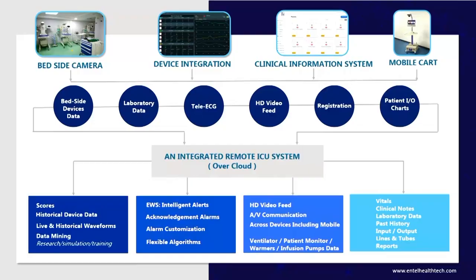You can set alarms from here because now there is a protocol-based solution for all these newer advanced monitors. If the medical officer doesn't know that this patient is more vulnerable, a patient with some valvular heart disease, so we have to take care about tachycardia, you can set the alarm from the command center. So that is about device integration.